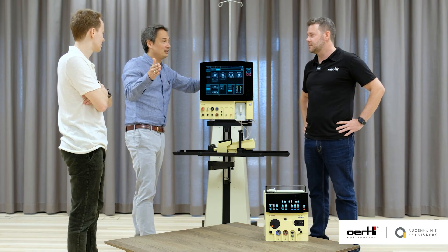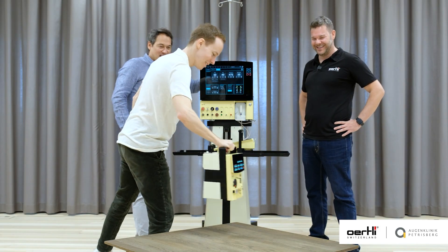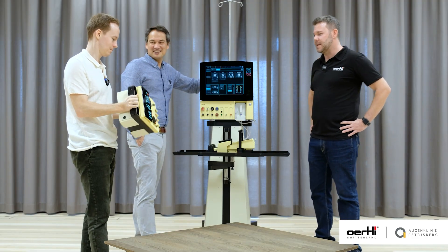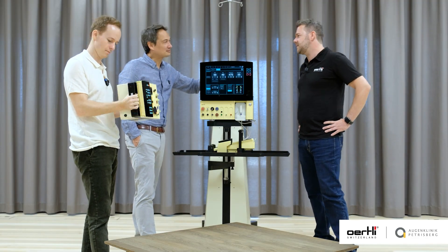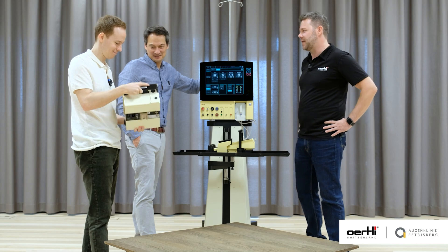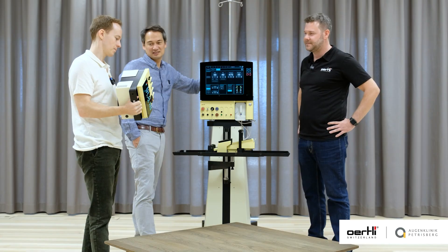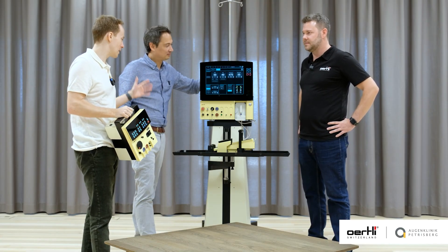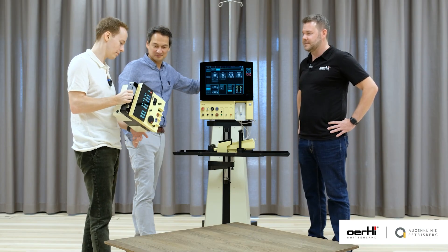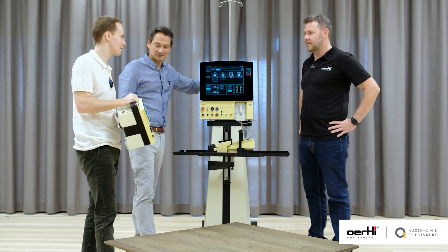But if you are in the jungle, jumping out of a plane and you need to do a FACO — you can just grab it like this. And it comes in a very cool bag — a leather bag that looks really like the 50s, like those pilot cases — so when you take it on the plane, you can also pretend to be a pilot. The amount of technology inside this machine even tops the OS4 because of its size.